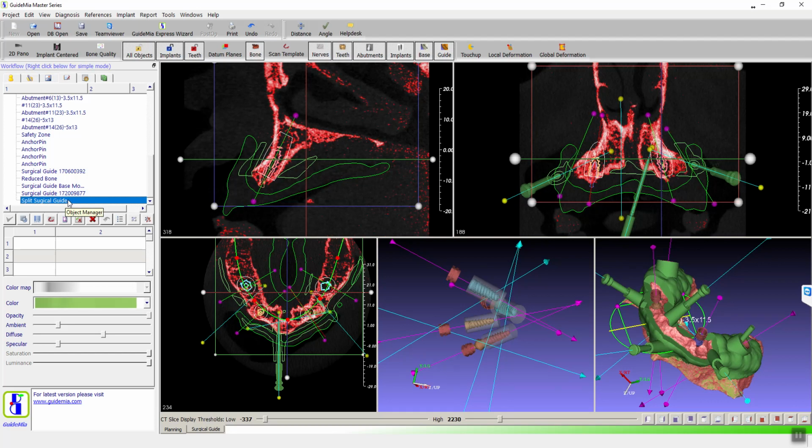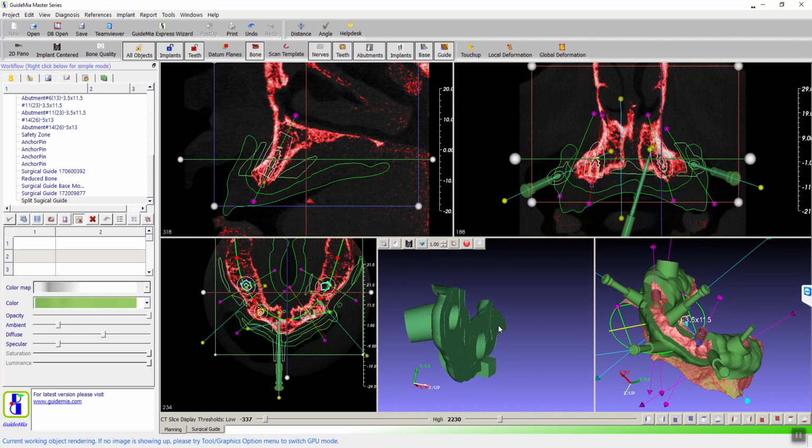It depends on a couple of factors. Well, first of all, we didn't have any taper here, so it's a straight square. It definitely will be easily taken out. And another factor is the printer itself.